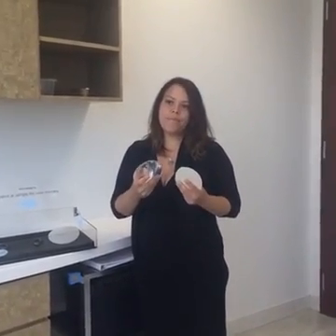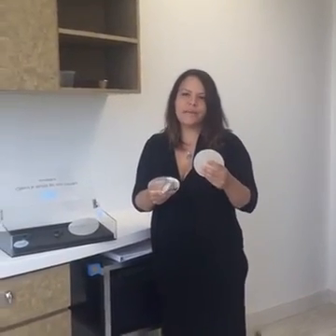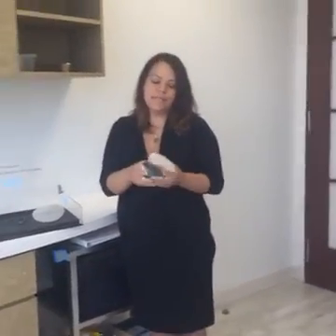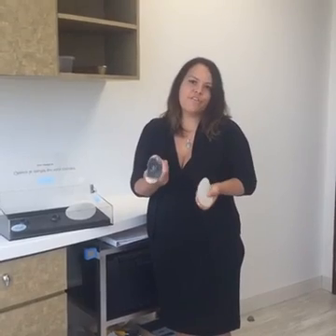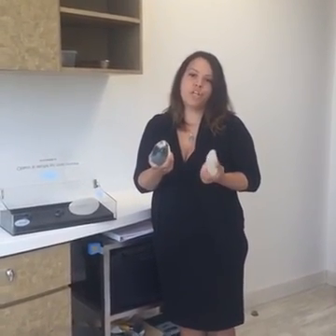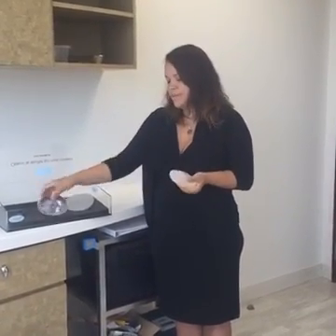There also are some studies that are a little bit controversial talking about whether a textured implant might have a lower rate of something called a capsular contracture. Capsular contracture is where you get a tight scar around the implant. And so that's a discussion that you need to have with your surgeon, because there's sort of ever-changing evidence in the field of implants, and that can lead to a lot of confusion and a lot of discussion. So that's 4 factors: the size, the shape, the material that it's made out of, and the texture, that are really important when you're selecting the right implant for you.